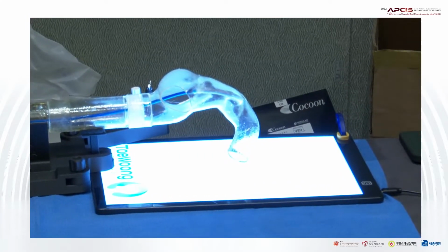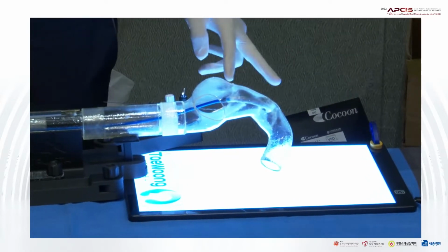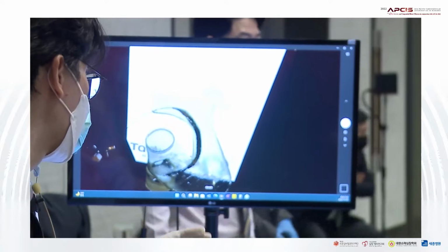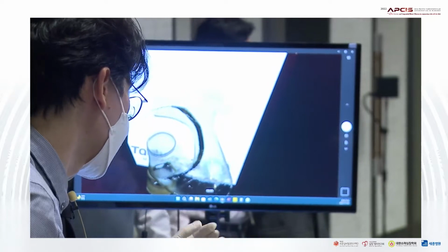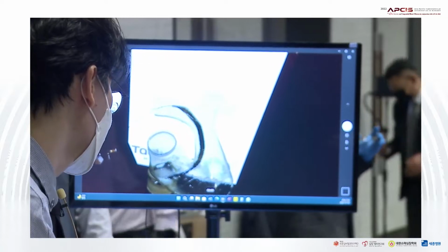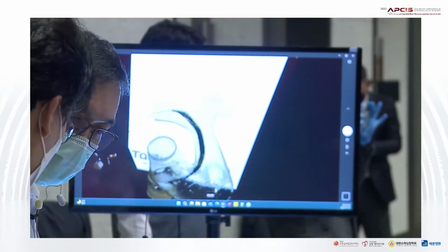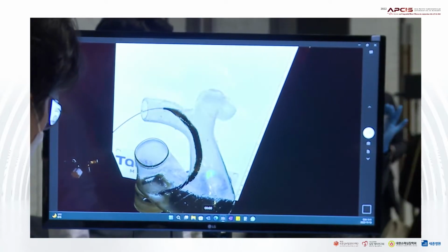Okay. Yeah, so like that. So now the valve is in place. Normally, you're going to deploy the valve a little bit distal and come back, right? Actually, which is better? I think usually with the balloon expandable stent system, we can deploy at the narrowest diameter, I mean the choke point, but with the self-expandable system, we deploy the distal part and drag the proximal. Okay. Now, So-Ick will try to deploy the valve slowly. So in general, Dr. So-Ick will rotate clockwise.